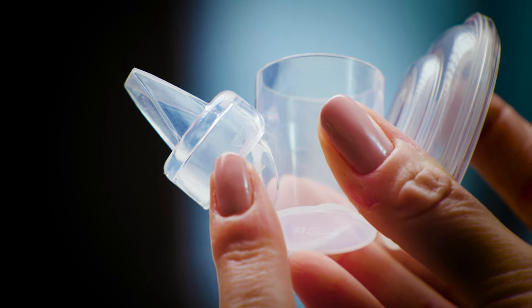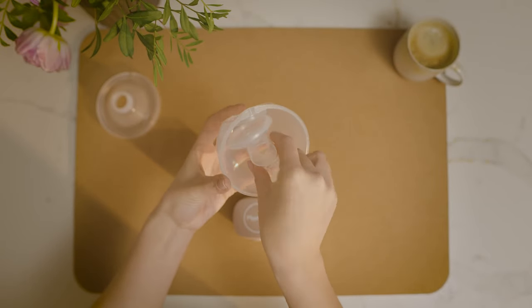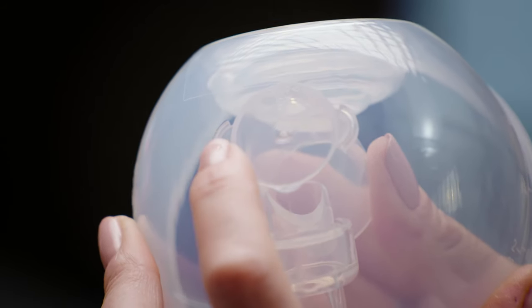Once this is done, firmly press the diaphragm up into place in the collecting cup. Ensure that the ears of the linker are aligned and press into the brackets at the front of the milk collecting cup.